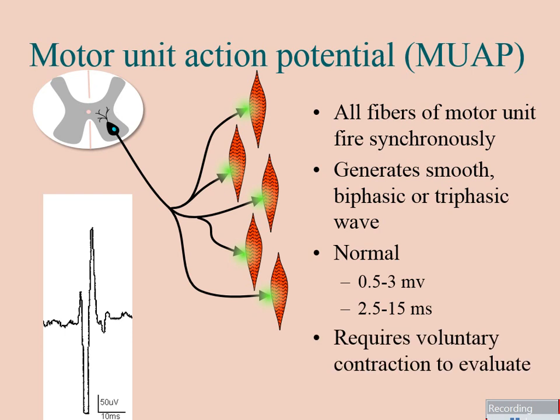And in people, they can actually quantify motor unit amplitude, duration, that sort of thing pretty easily. They do an EMG on you and say, just relax, okay, try to contract that, try to pull your finger up ever so slightly, and you'll start to see these motor units.